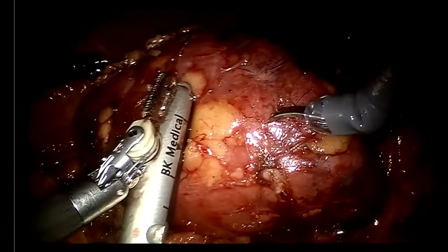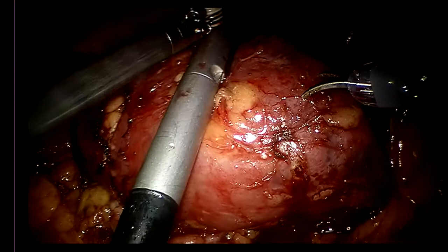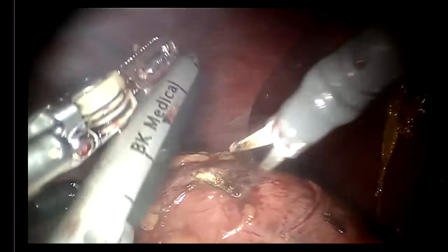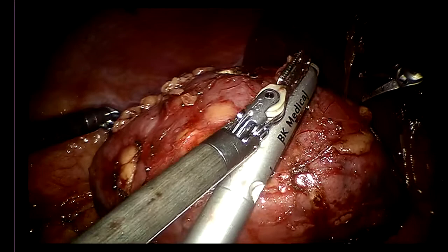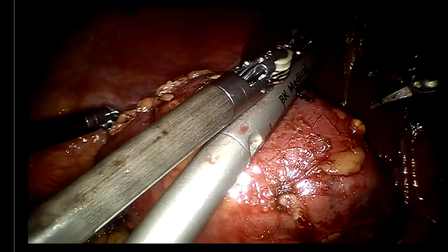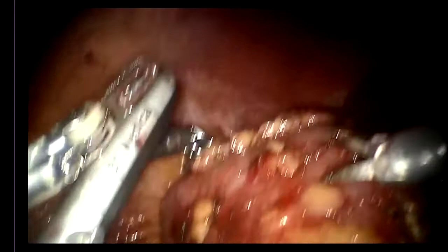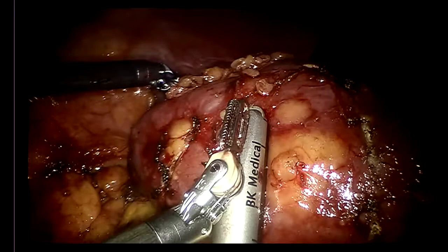So here's the tumor now. All tumor. Gone. So it's gone here at this spot. Tumor out. So basically connecting this dot from here over here. So over here we've scored up to there. Let's check this. This is all tumor.